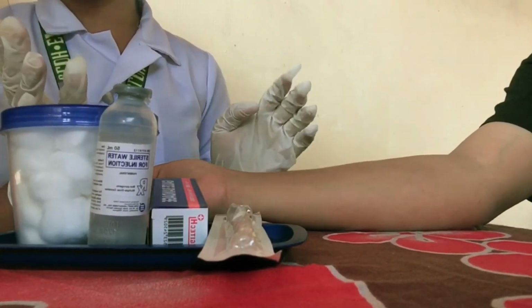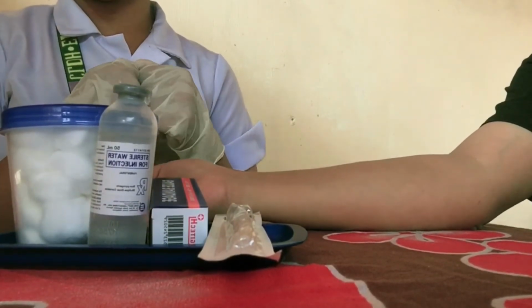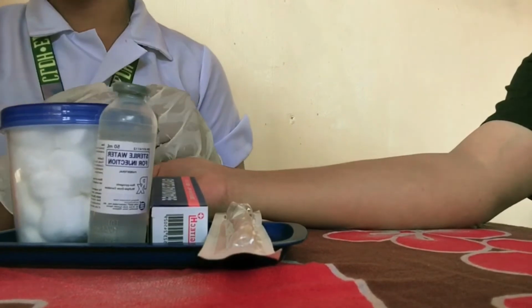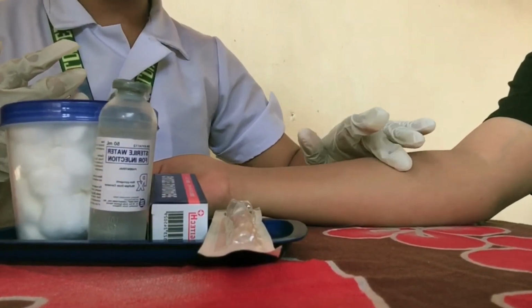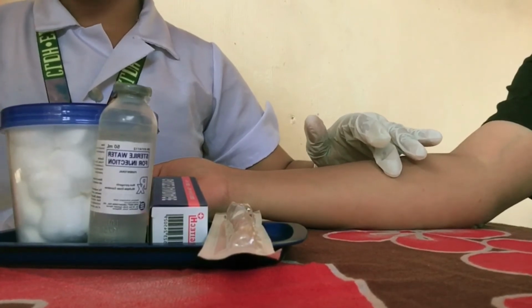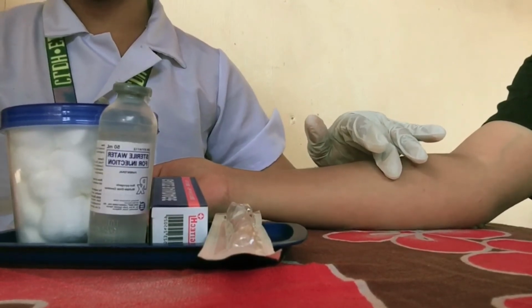In choosing the side where we will be injecting the fluid, we need to avoid the side that is swollen, has a lesion, is inflamed, or is tender. For this side, it is clear, there are no lesions, no tenderness observed, and no presence of inflammation.